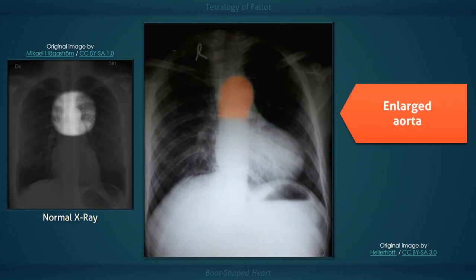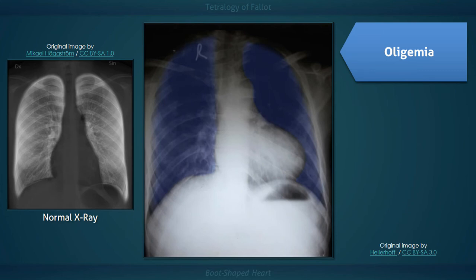The fourth defect is an overriding aorta, which along with pulmonic stenosis and a VSD, facilitates the shunting of blood away from the pulmonary system. This results in a large aorta, which in a significant proportion of patients is right-sided, and decreased pulmonary vascularity, which is visualized on this x-ray as diminished lung markings — that is, increased blackness of the lung fields.